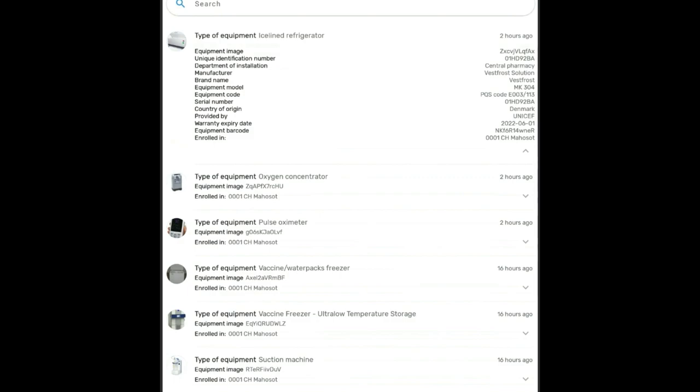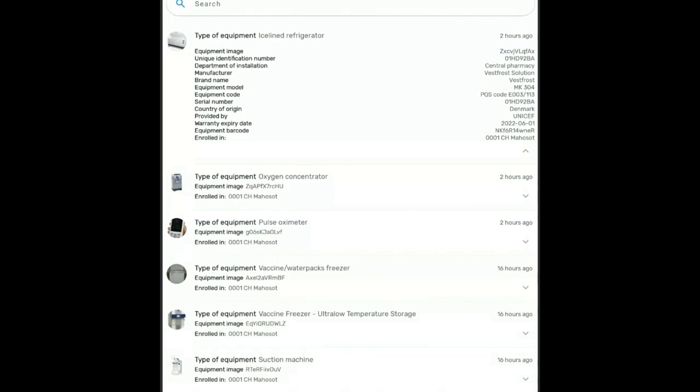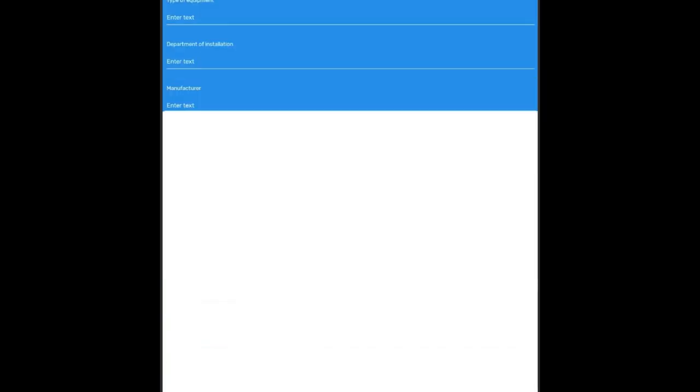You can also tap on the small icon and it will show the equipment image in a pop-up. Now in order to make an entry for that specific piece of equipment, you can tap on the search bar.